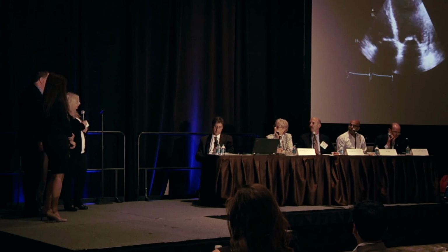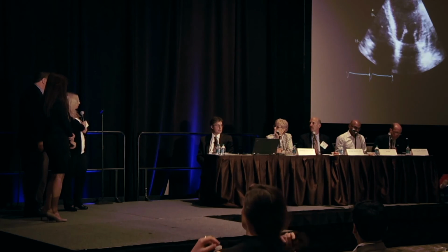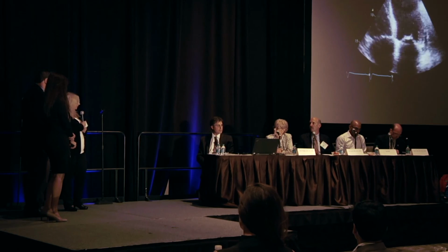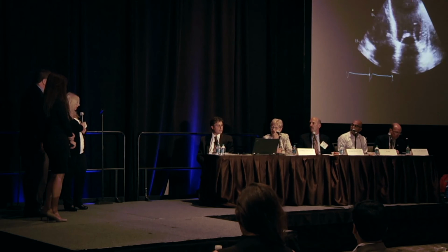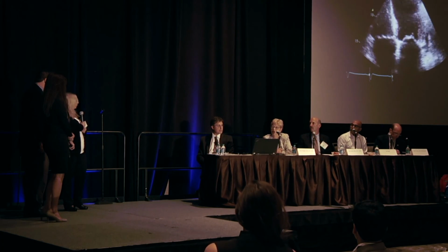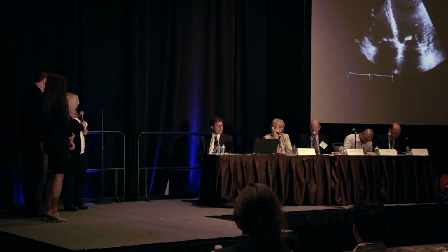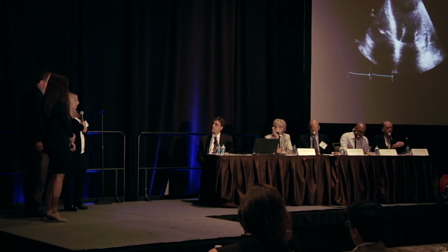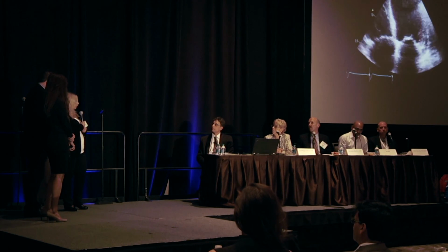Some are based on speckle tracking, and after that, to approximate the border, there are various families of algorithms, some of them template matching to existing templates. Our algorithm is different. It is based on local contrast and treats each clip, each image of a different heart, by itself. This is basically the difference, and this is why it works with contrast.